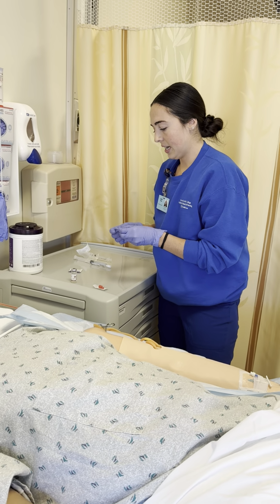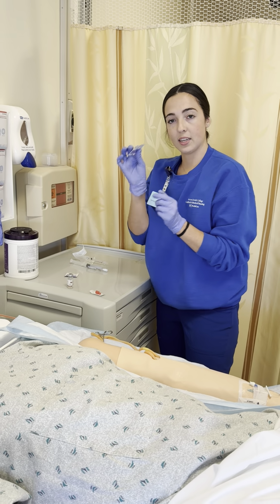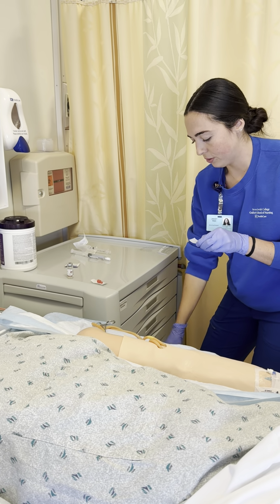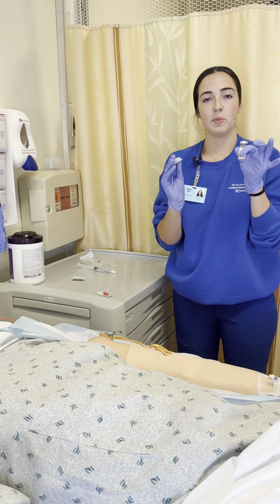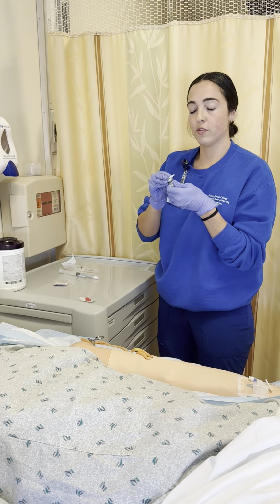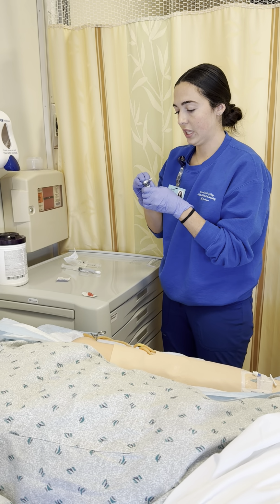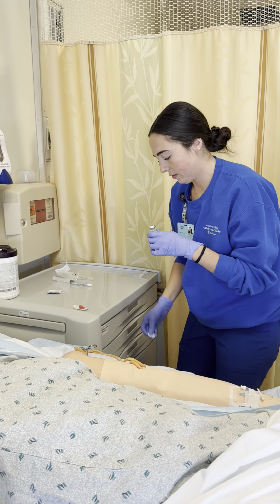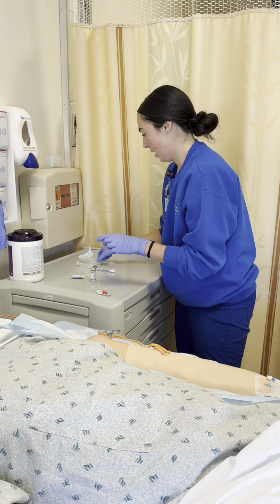Okay. And I am going to take my alcohol pad, and I am going to scrub the hub of this just because it is a community vial. So for 30 seconds, take a couple deep breaths. 28, 29, 30. Throw that away now. All right.